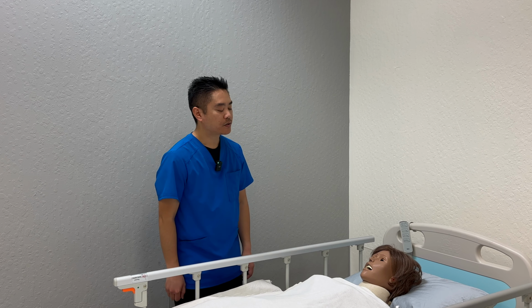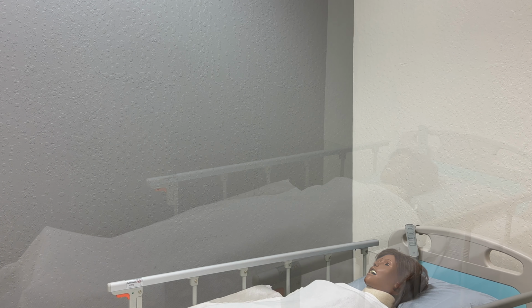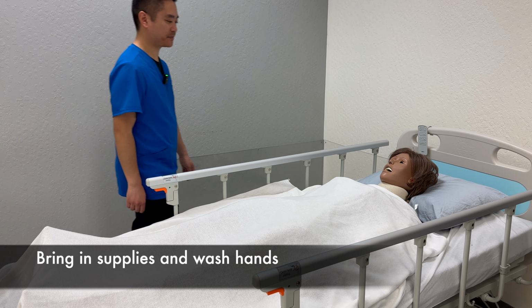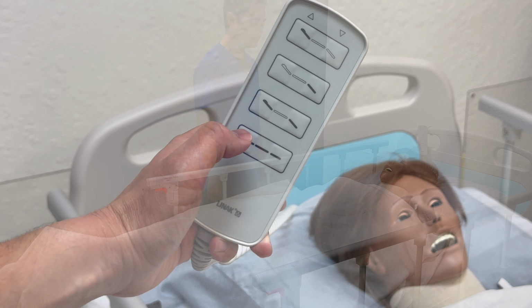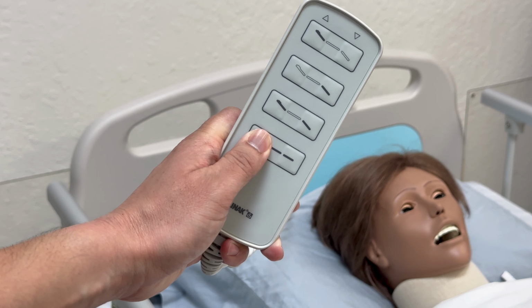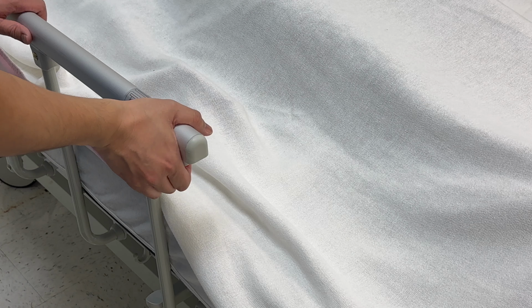So I'm going to go ahead and close the curtains, wash my hands, step outside, and gather my supplies. Knock knock. Mrs. Smith, I'm back with the supplies. Raise the bed to a comfortable position. Lower the side rail. Put on gloves.